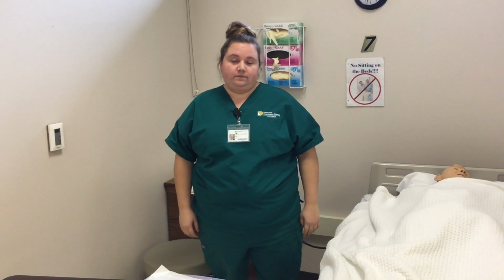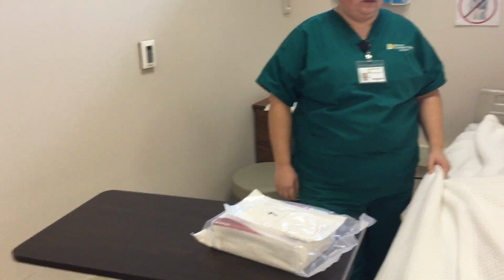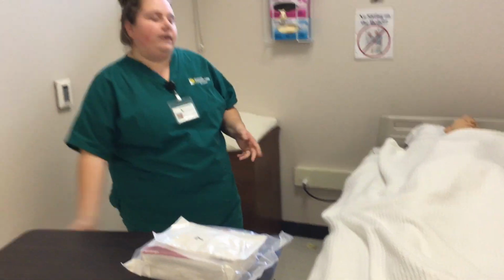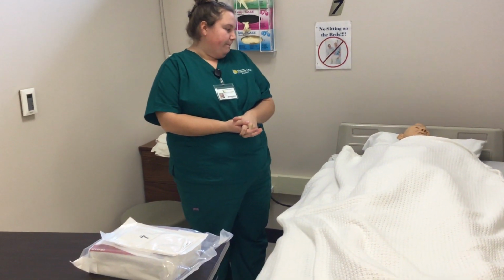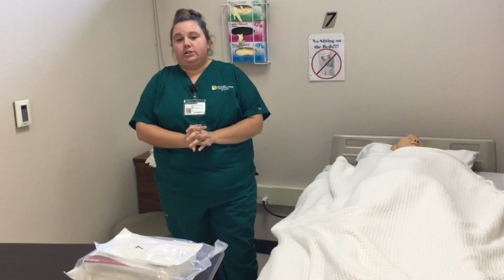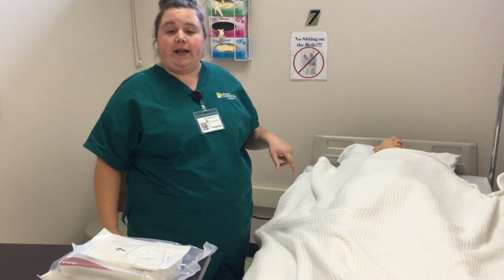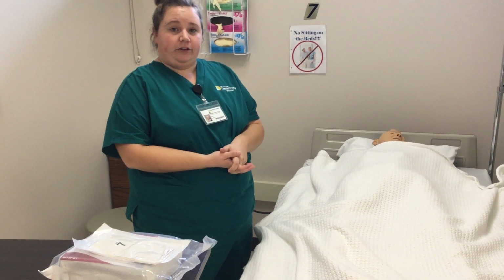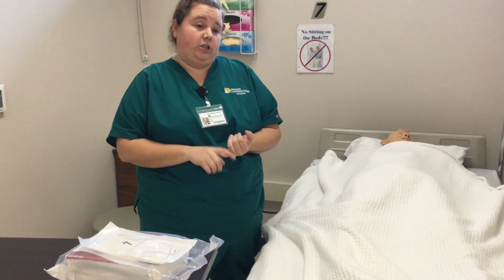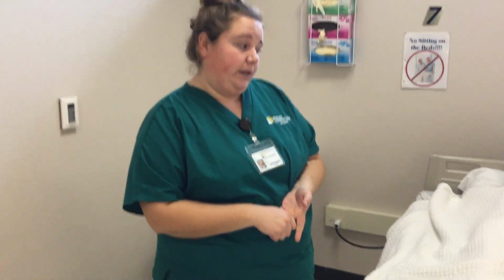This is Marco recording Katie inserting an indwelling catheter. So I come in. I'm going to review the patient's medical record, including the healthcare provider's order and nurse's notes. I'm going to review any prior catheterization, the patient's response to the catheter, the size of the catheter, and the time that the catheter was put into place.